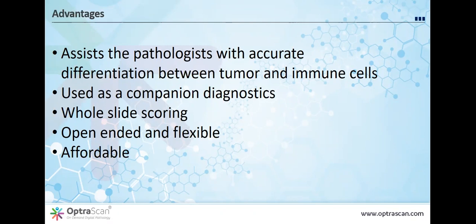So, Isha, thank you. I've been watching the little chat box and some questions that are coming up. I think we can obviously try to deal with the questions. One of them I noticed really related to how did Optra establish the ground truth as to what the score is and what the cells are. And it's a great question, and it's a key question.